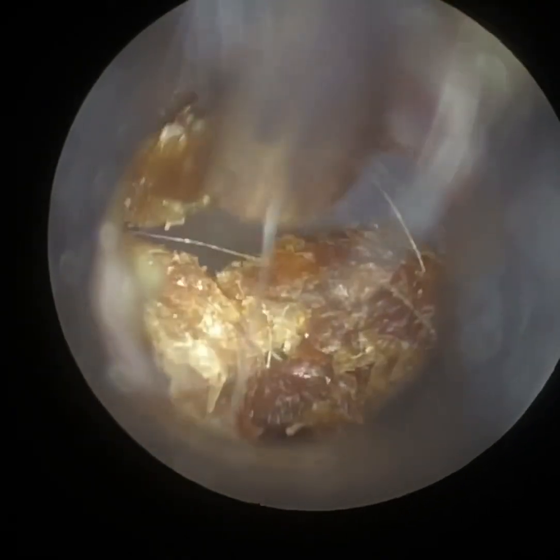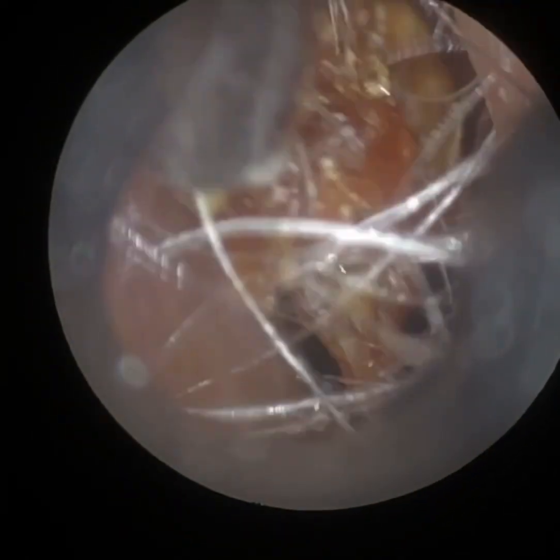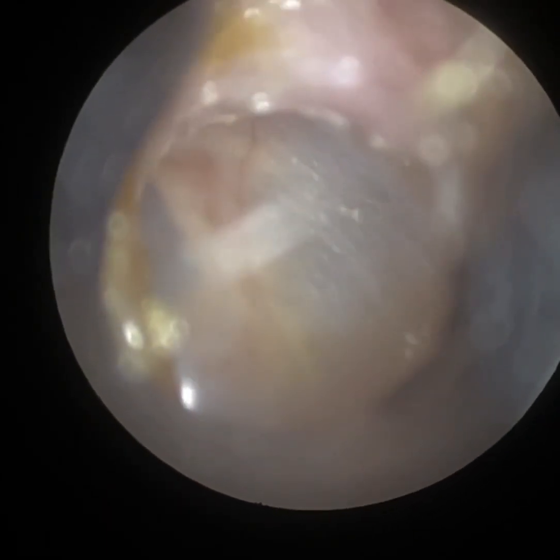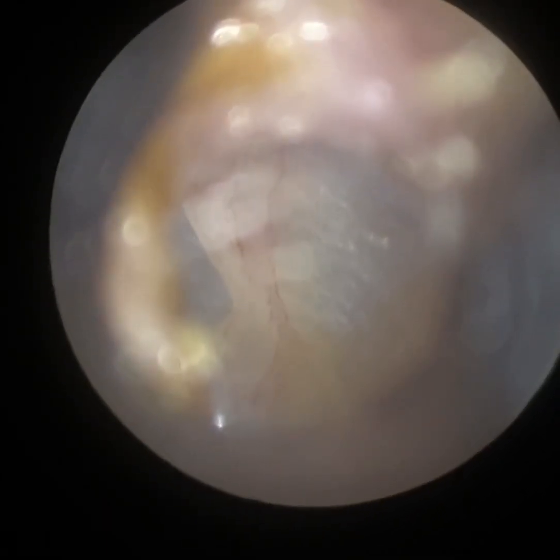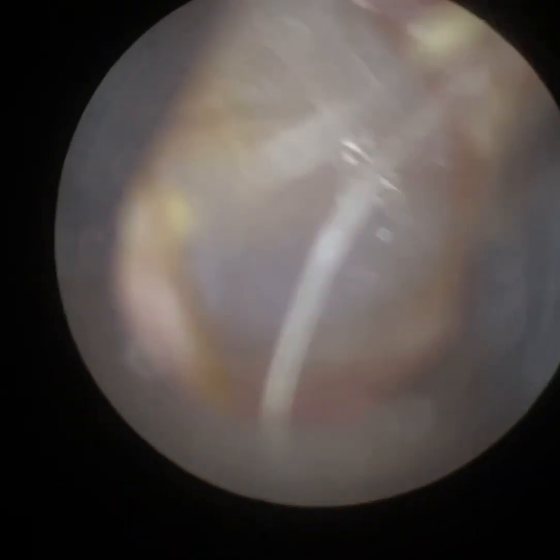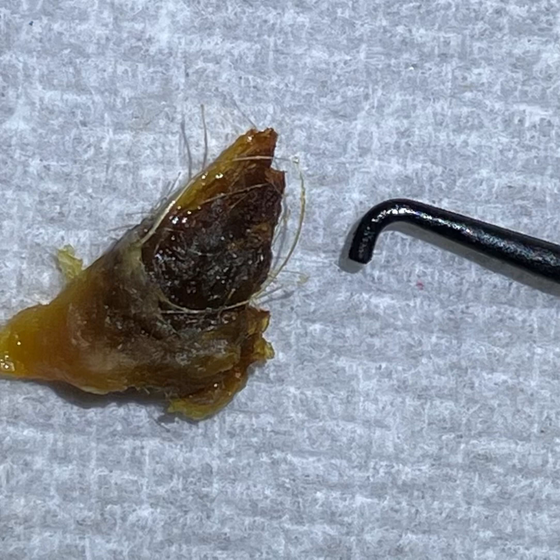I just want to make sure I get a good suction grip here. And the skin came out with a long tail. Now you're able to see the dip on the patient's roof of the ear canal. I'm stretching the ear open just at the top there — the ear canal dips down and then it goes back up again, so you just can't fully see the short process of the malleus. I'm just going to see if I can stretch it a bit more — just see the short process there now. You've got a really magnified view of the ear. See the blood vessels once more. So that's the lump of wax I removed from the patient's right ear with the ear hook — it gives you some perspective there.